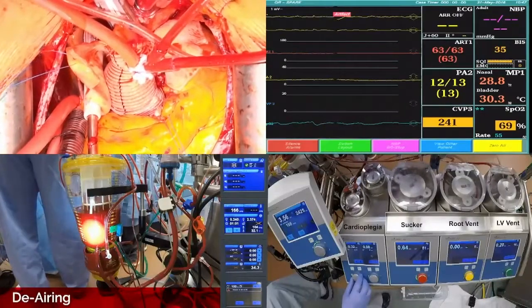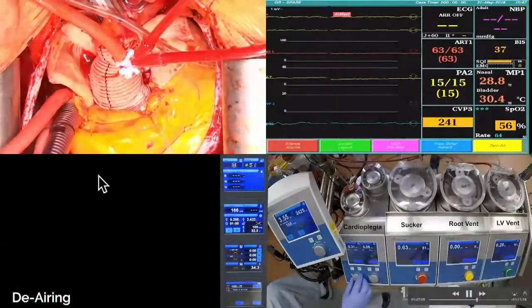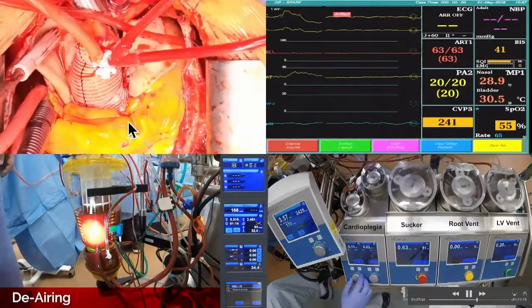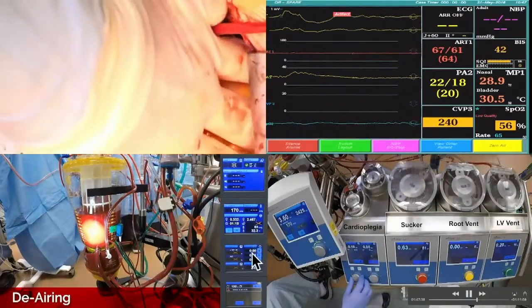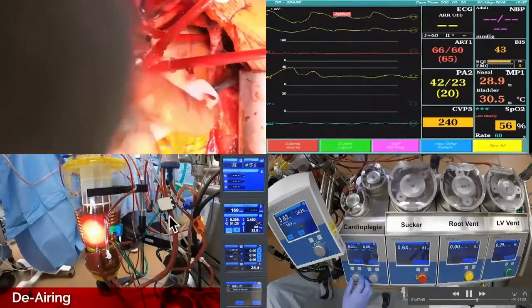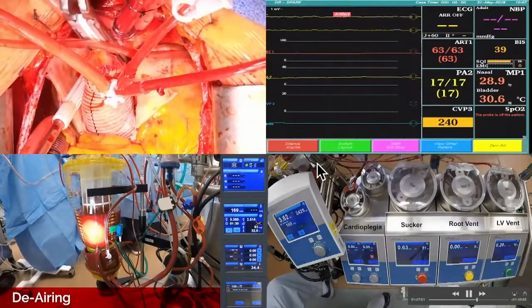Yes, because you can see it's distended. See the root right here, there it is right there, distended. And I'm poking it to see how tight it is. What's your pressure, Patrick? And our pressure's right here. I usually get it up to about 180 on the measured pressure. So the systemic pressure right there is 74. Okay, now we're going to switch to retrograde again.